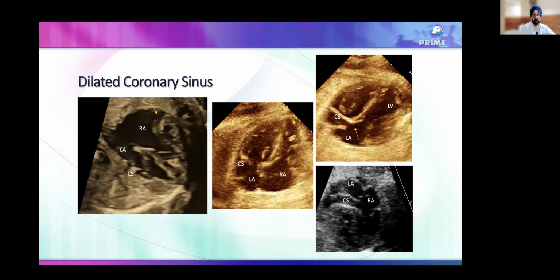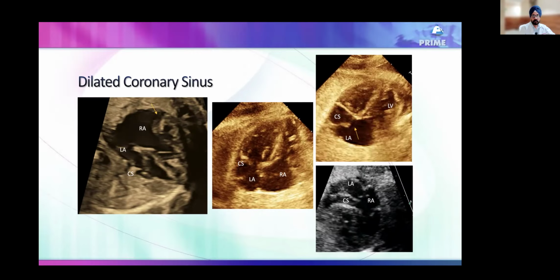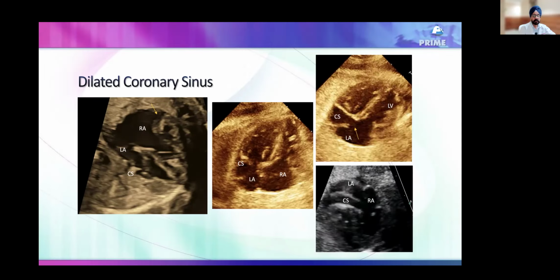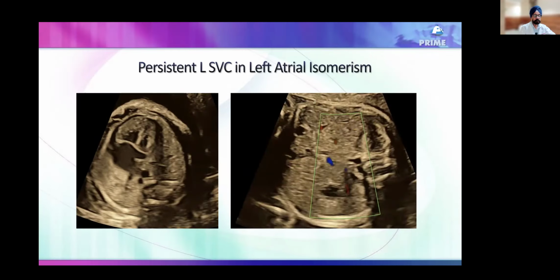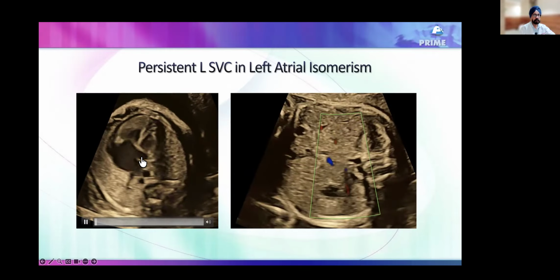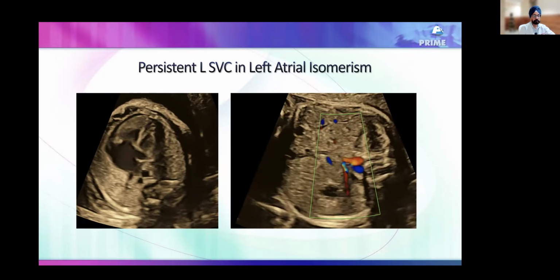Please, whenever you see a dropout, rule out dilated coronary sinus before you commit that this is ostium primum ASD, because that's far more common. So this is again that dilated coronary sinus. And it's obviously so because the tricuspid valve is opening, you don't see the mitral valve opening, and you have an RA and RV dilatation, minimal pericardial effusion, some cardiomegaly in this patient.